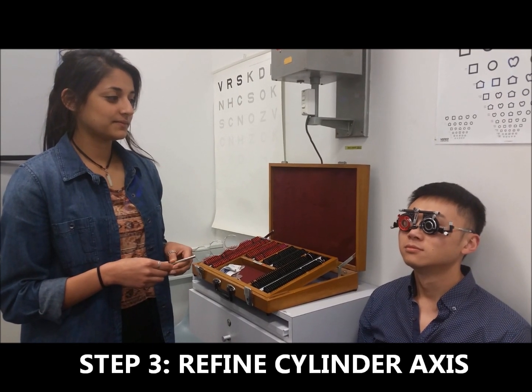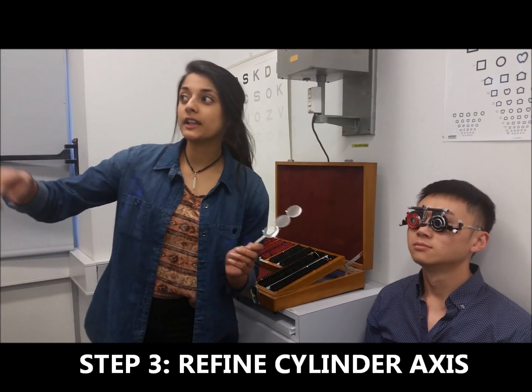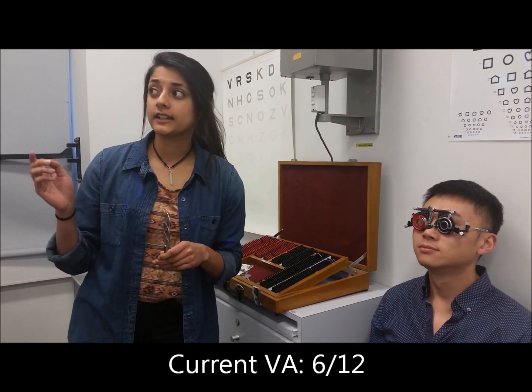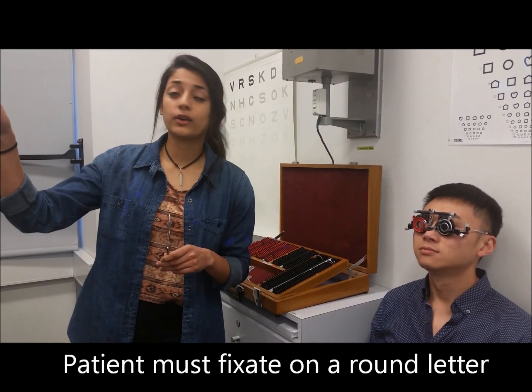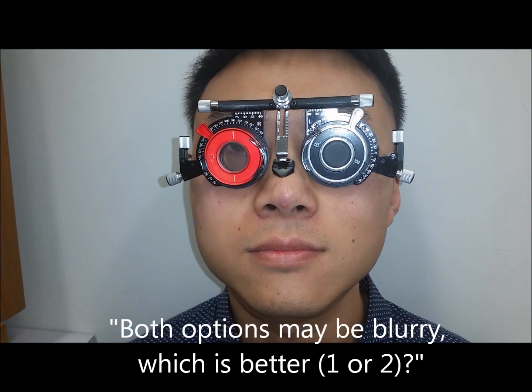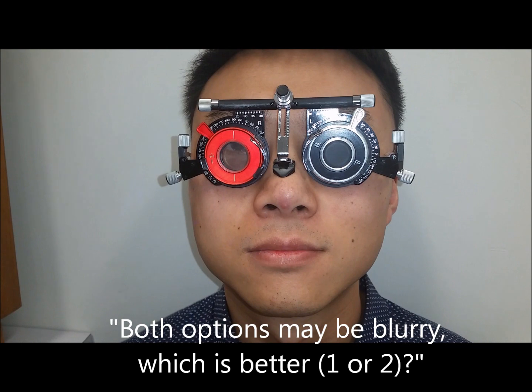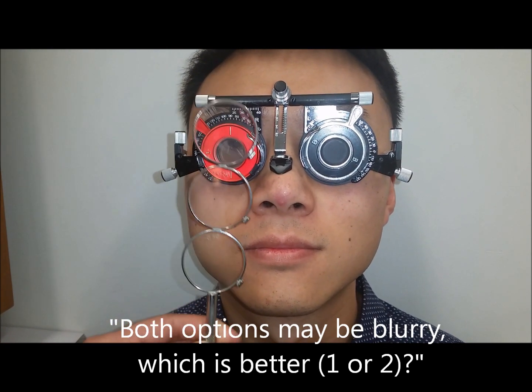Step 3. Refine the cylinder axis. Yep, Hongbin, so I'm just going to get you to read down to the lowest line you can read now for me. X H O T A. Yep, and can you get down any further? No, I can't. Yep, so I just want you to concentrate on that O for me now. Okay, so both options may be blurry, but I just want you to tell me which one's better out of the two. Better 1 or better 2?